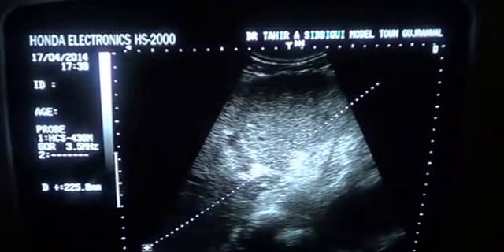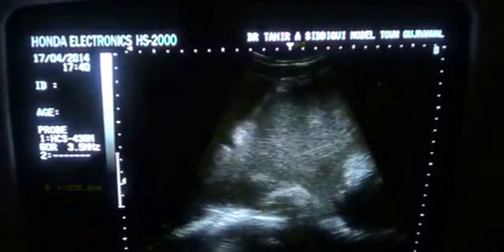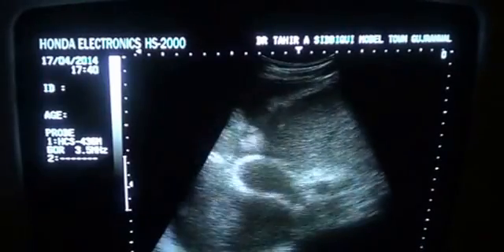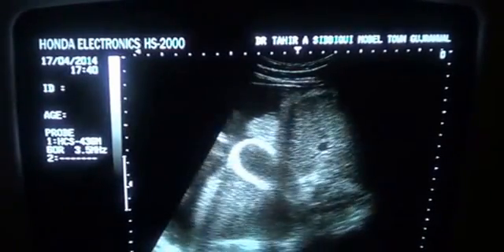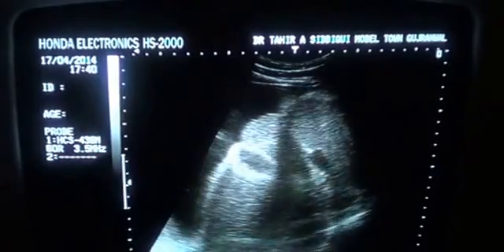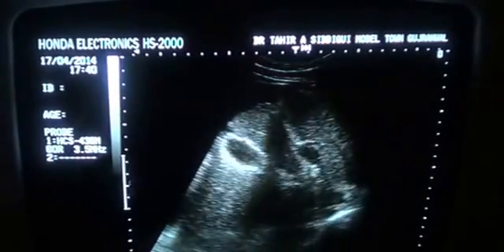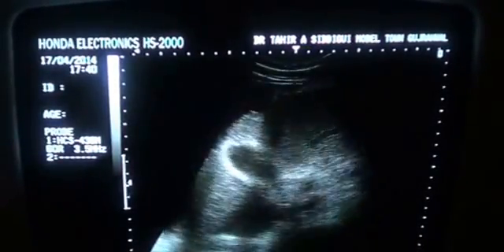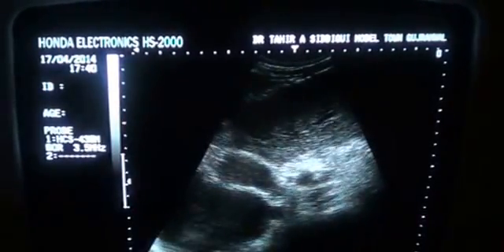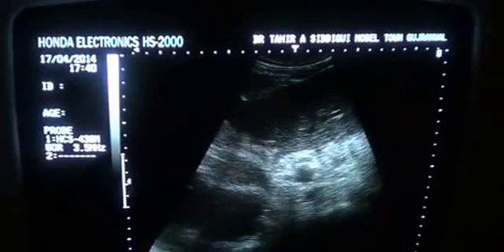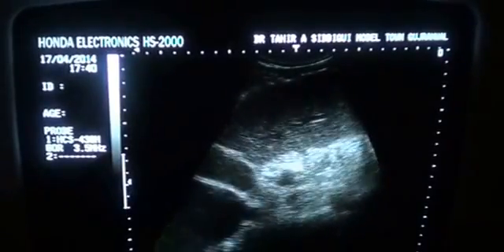I disagree with this method of measuring the liver. If someone has to donate the liver, or liver transplantation is due, this cm or mm measurement has nothing to do with that. As I have said repeatedly, the liver can be measured in cm or mm with the A-mode method, and not with the 2D real-time mode method.